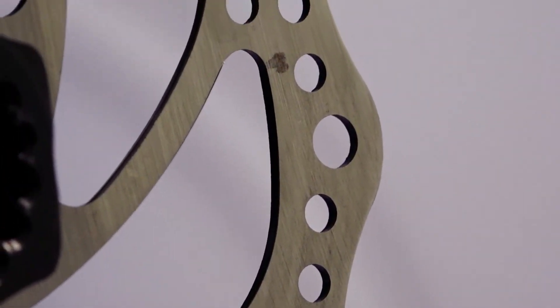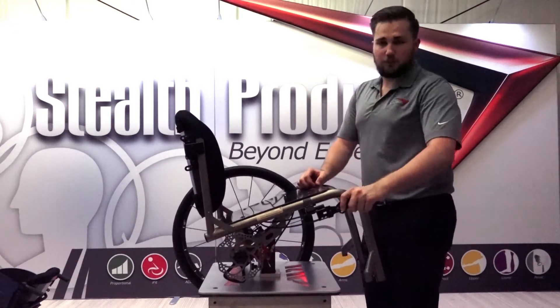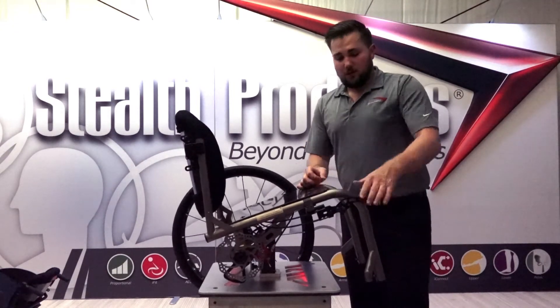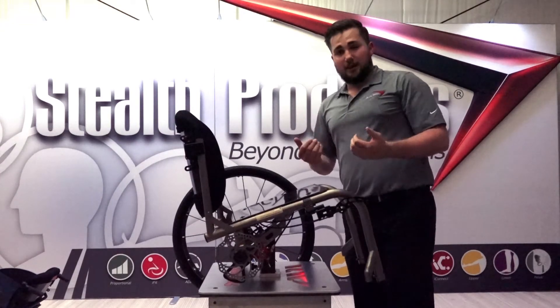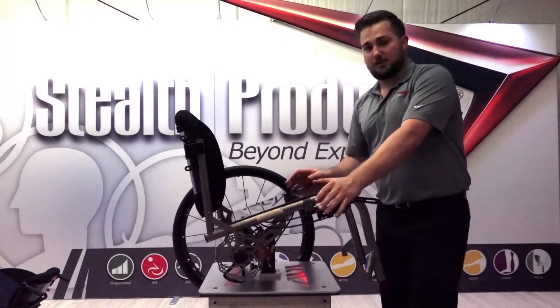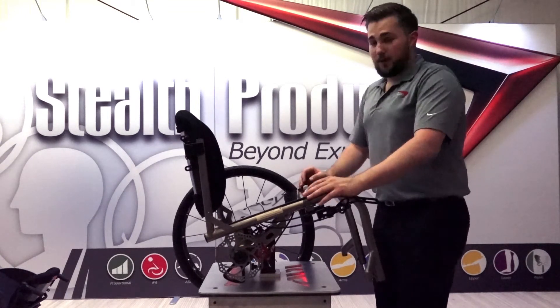The disc brake system comes with multiple different lever interfaces. The variable lever is one of the more popular styles. We also offer a bicycle-style braking lever called the pair lever — it's actually two levers mounted one on each side of the chair, with each lever controlling its side independently, granting the end user full chair control.